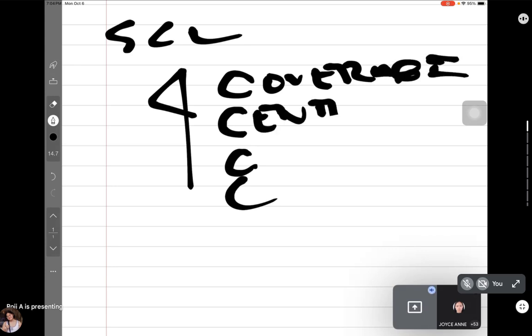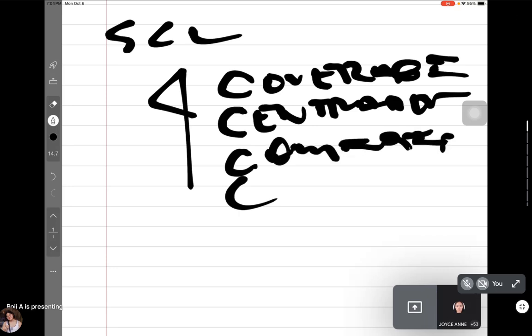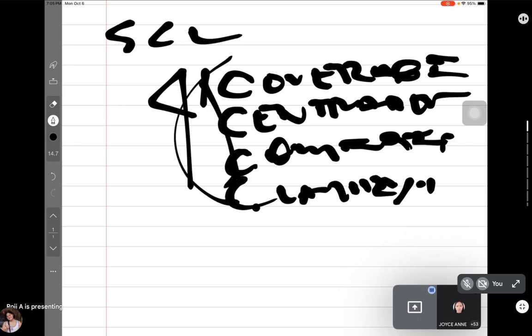Next is centration. Next is clarity or comfort. Last, clarity. Okay. Doc, can I interchange? Yes, you may interchange. It's not too strict. This needs to always be number one. You can interchange. Think outside the box. You can do this. As long as you do all of it, it's still good for me. Do you understand? Do you have any questions so far?